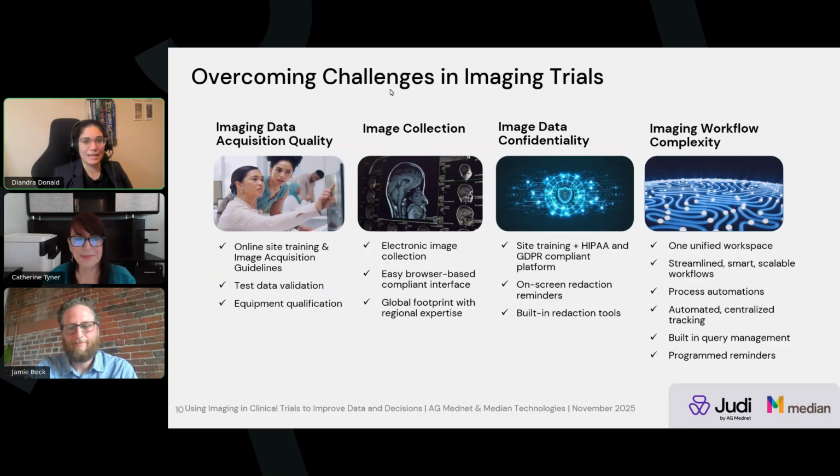This guideline highlights de-identification requirements, scan collection instructions, and recommended parameters across several modalities. It may also be necessary to conduct a test data validation process if the imaging requirements are complex. Test data validation is a process where sites provide test images to the core lab and are signed off on their technical data acquisition prior to producing any actual study data.